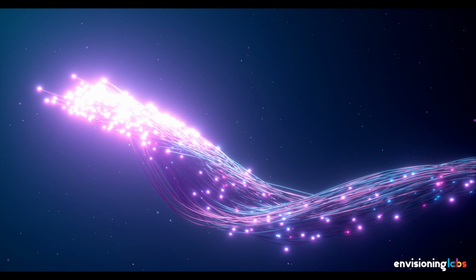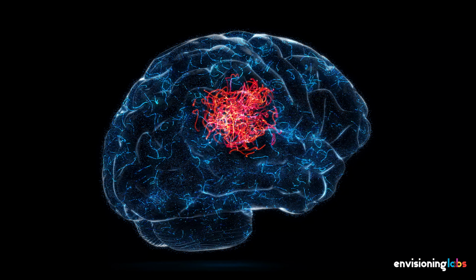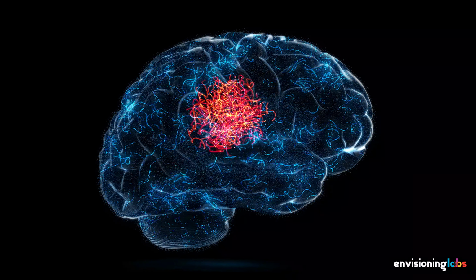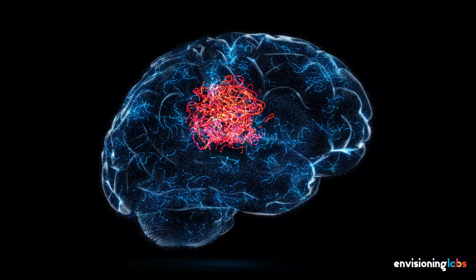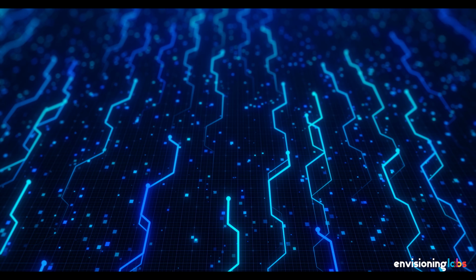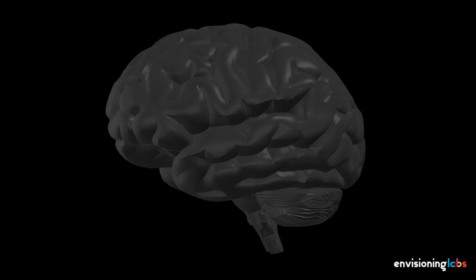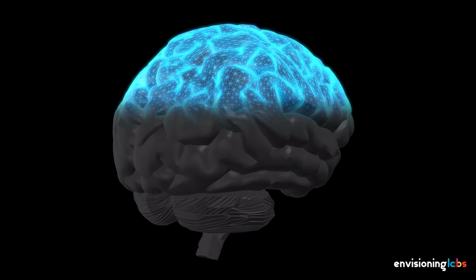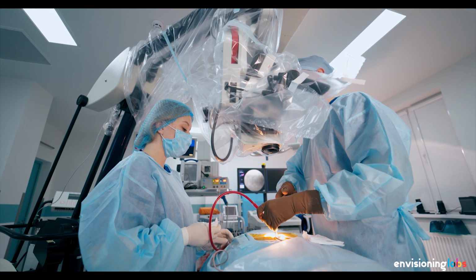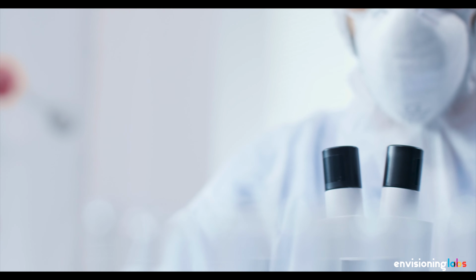Structurally, the tumor fibers are less organized. Meanwhile, the brain fibers are organized in lines. When a light shines through organized versus disorganized fibers, it gives off a different signal. The signal information is translated into an image, which can be used as an overlay that could be turned on and off by the neurosurgeon when looking through the microscope.